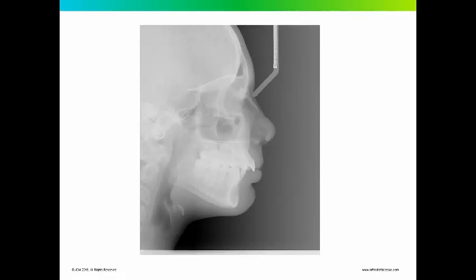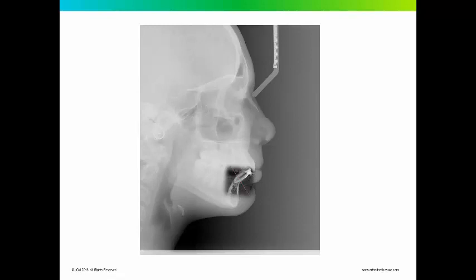What I did was I superimposed the alveolar process over the original, showing that the overjet correction was pretty much achieved by the repositioning of the lower incisors. And that's pretty much what I've seen with all these class 2 correctors. Personally, I'm not a fan of the position of this tooth. It's been pushed past the limit of the alveolar housing.